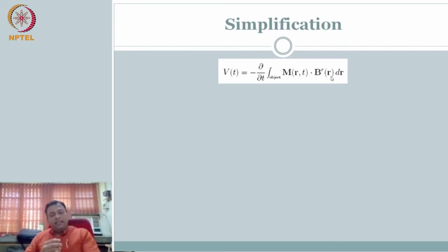Why should it be? Let's assume that I have a coil which is equally sensitive to all r, that is, if I apply a current, it creates a magnetic field at location r. That is how we got this B_R using the reciprocity. So we will say that whatever magnetic field, wherever it is created, it will proportionately create the corresponding voltage.